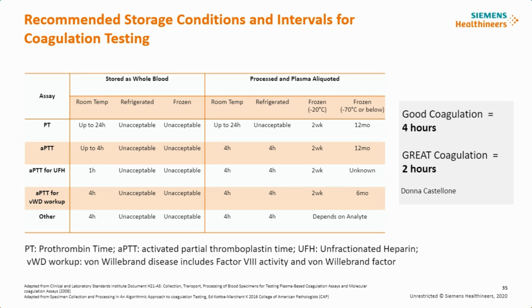Most oftentimes, if the samples are sent from an outside outreach facility, they'll be sent as frozen. This is where you would freeze the samples at -70, and then there's a specific shelf life that the samples are good for. Perhaps doing internal studies to define at what time point you feel comfortable in accepting those samples. I did that in my reference lab where I looked at -20 and -70 and saw at what time point I would be concerned about the results that we're reporting from these samples.